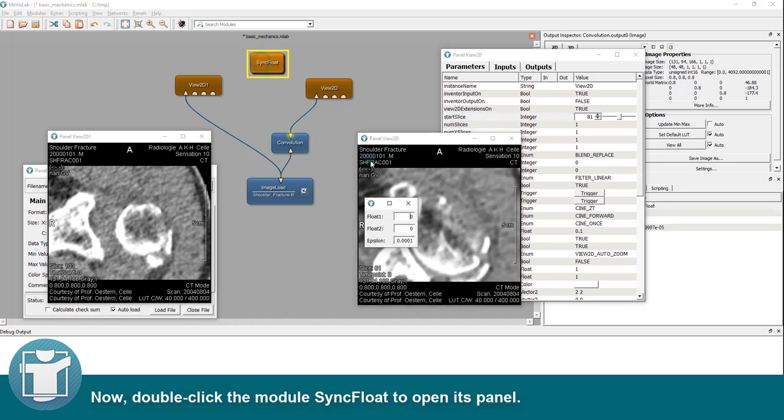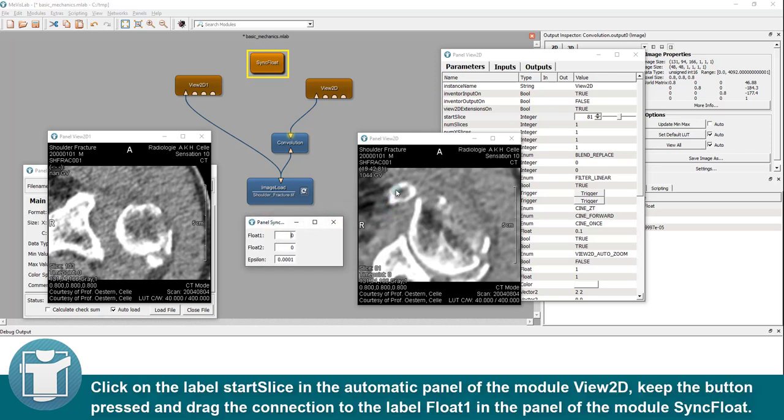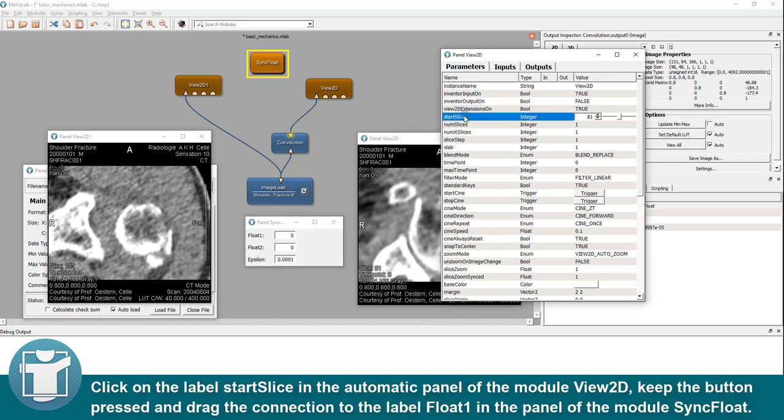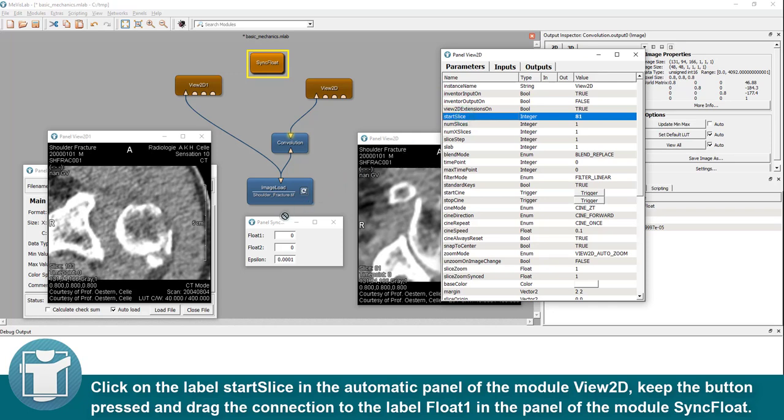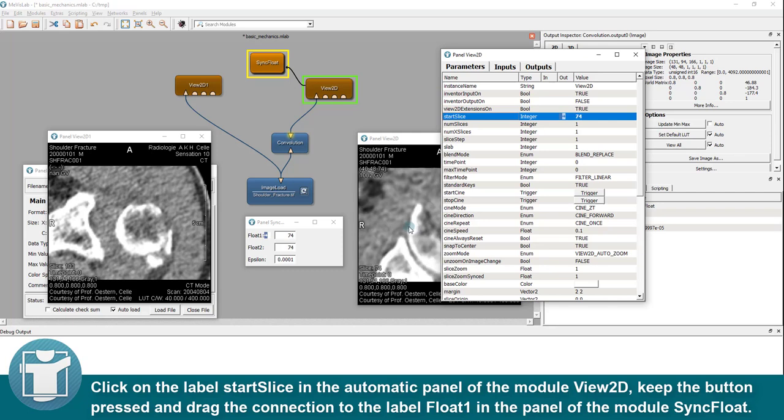Now, double-click the module sync float to open its panel. Click on the label start slice in the Automatic Panel of the module view 2D. Keep the button pressed and drag the connection to the label float 1 in the panel of the module sync float.